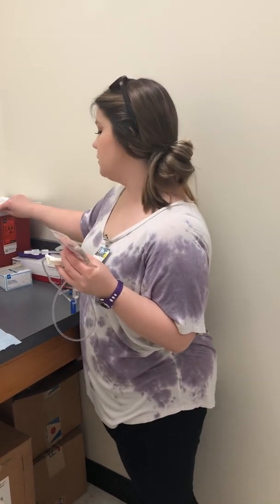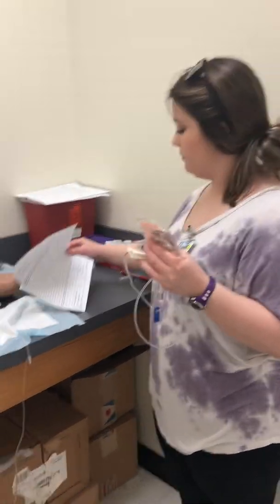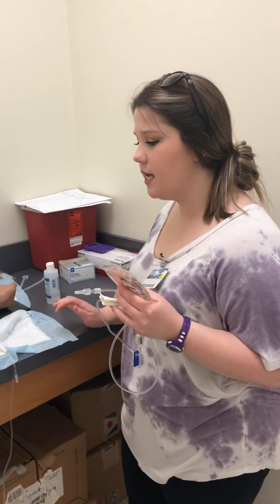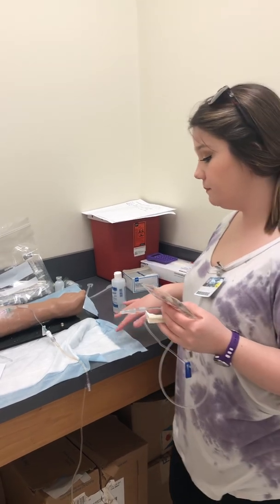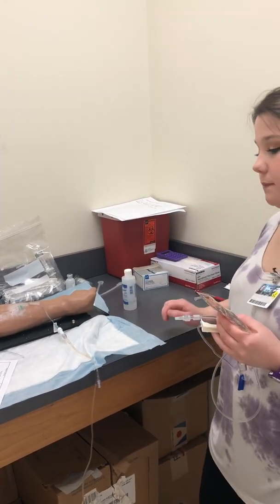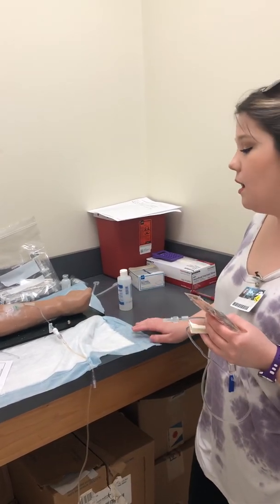Now that I've got my medication prepared and my tubing primed, I'm going to take my medication, my swabs, and my MAR to the room, and do my hand hygiene. Now that I'm in the patient's room, I'm going to say my name is Hannah. I'm the nurse taking care of you today. Today I'm going to give your antibiotic to you, okay, and it's gentamicin. Then I'm going to ask the client to state her name and date of birth. After she's done that, I'm going to ask for allergies. It says here that you're allergic to penicillin, is that correct? Okay, do you have any other allergies?